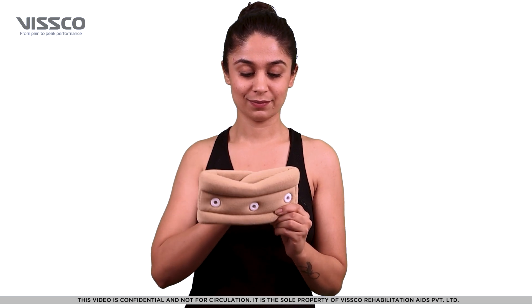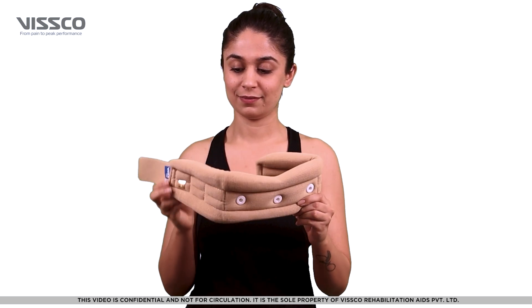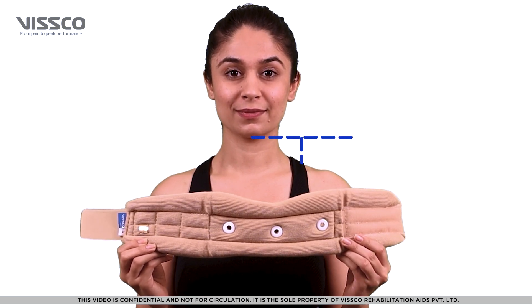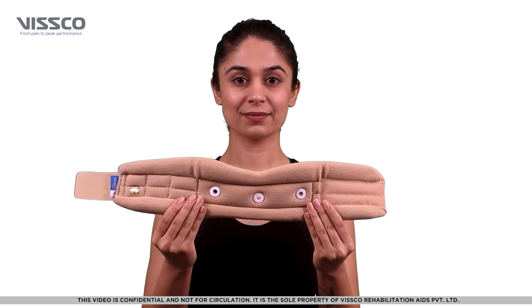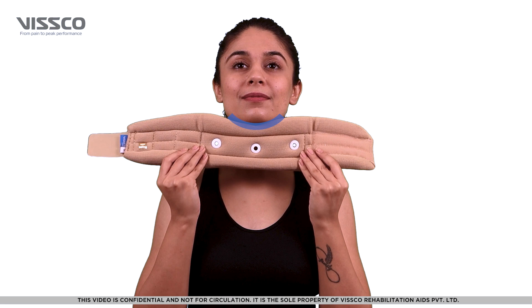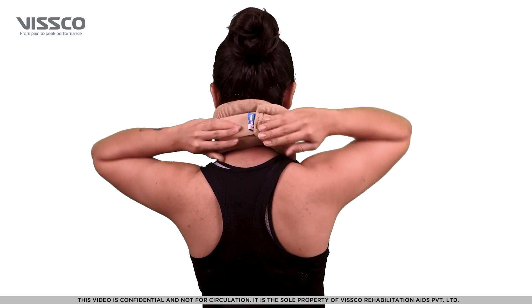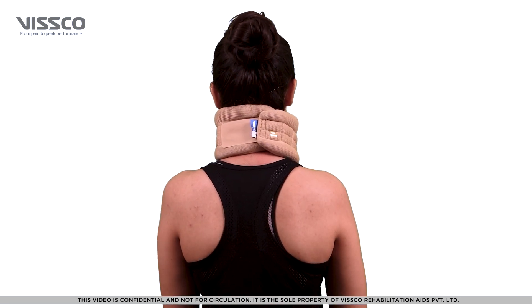First, unfasten the velcros. Stand straight, look forward, with your chin up. Place the collar over the neck so the curved part comes below the chin. Lock the collar with the velcro to a comfortable and snug fit.